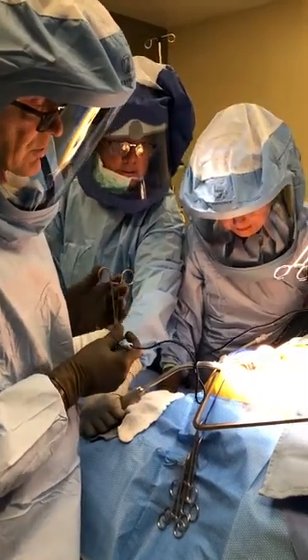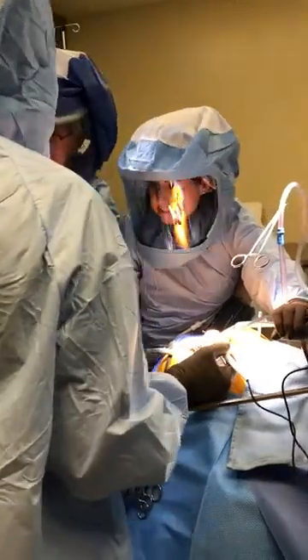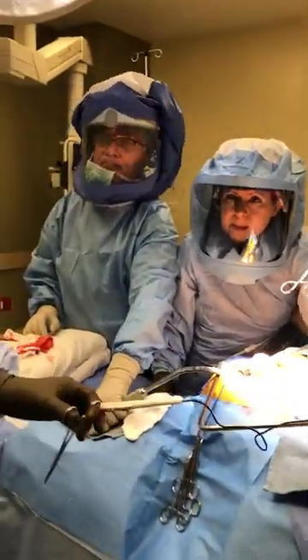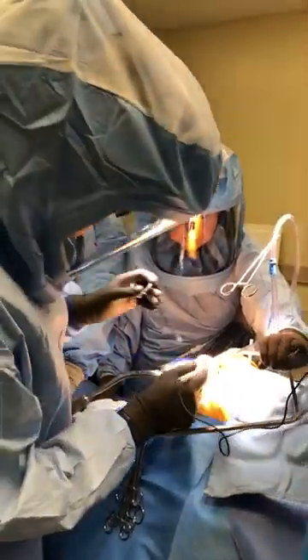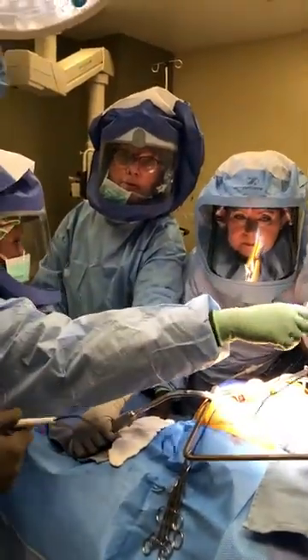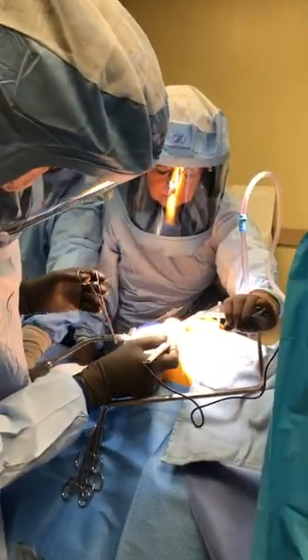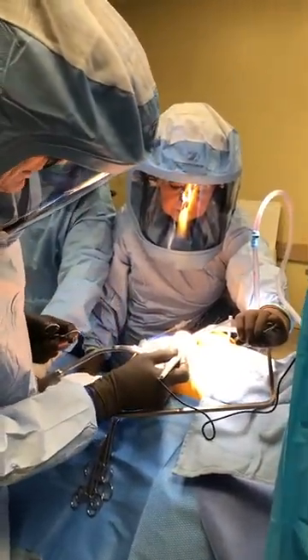So we've got the femur exposed here. It's a 4-inch posterior incision. He's a thin guide, BMI 28, and good bone density. He's 69, but he's got a T-score of positive 2.6 on the femur, so he's a low fracture risk candidate — basically zero chance of fracture.